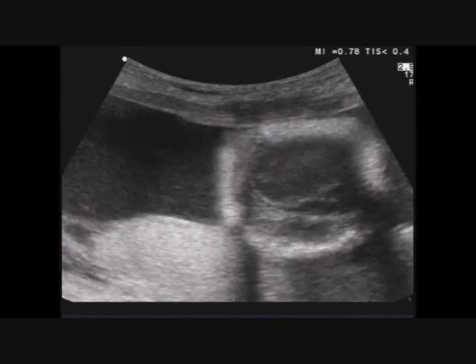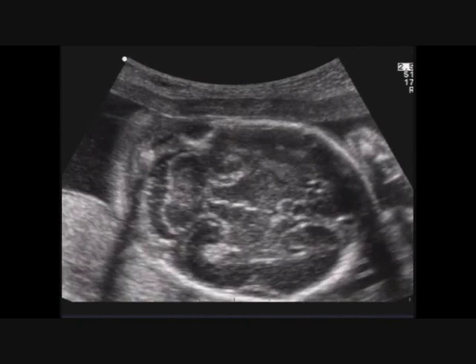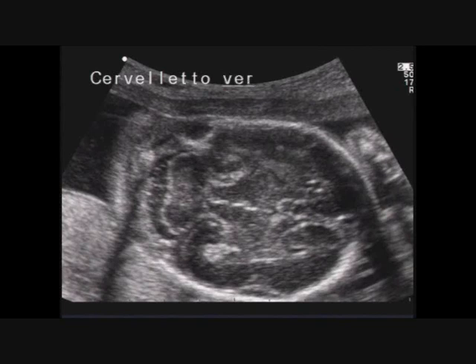You need to do a careful study of the anatomy, remembering that the confusion that you can see on the median line must raise big concerns. You need to study everything. In this image you can see the cerebellum, and you must pay attention also to the cerebellar vermis. And why? Because the presence of associated anomalies of the central nervous system is very high.